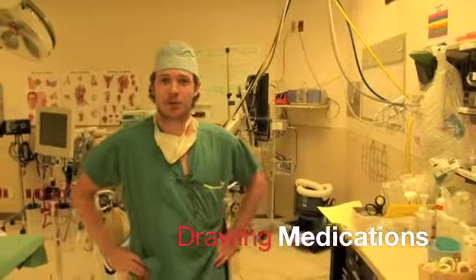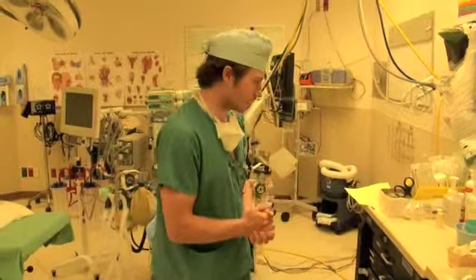Okay, so today we're going to be doing a quick video on how to draw up solutions into syringes. Just to be clear at the start, drawing up solutions is a particular issue depending on the staff that you're working with, so make sure to discuss it with your staff before you go ahead and start drawing up medications. Okay, so let's get started.